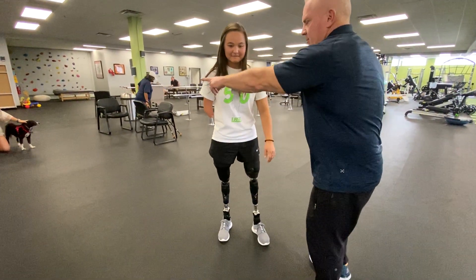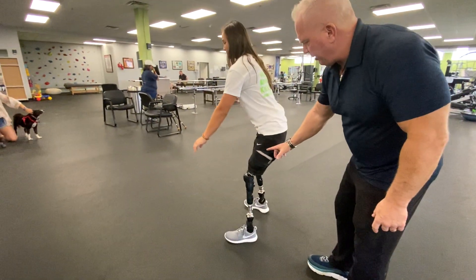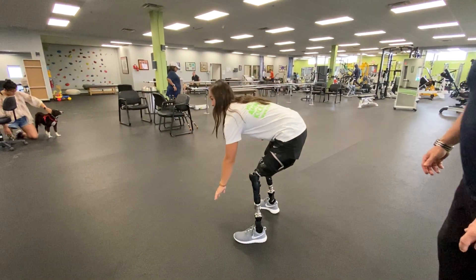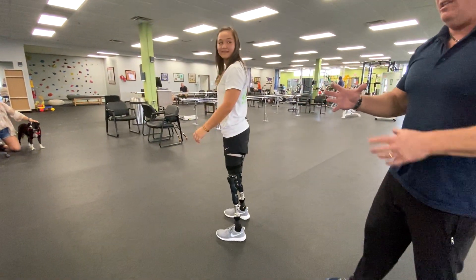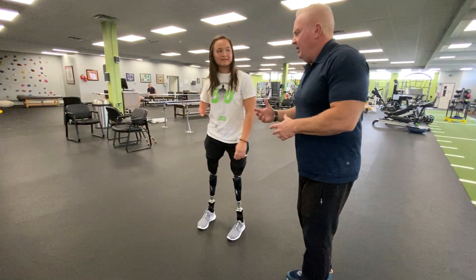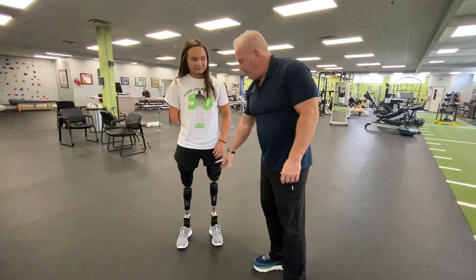Even when she turns sideways, she's able to bend down and touch the ground and fire her muscles without the knee giving, because she can stabilize everything with the muscles. And she's already seen her leg really tighten up since she's been wearing it, because she can actually fire her muscles.